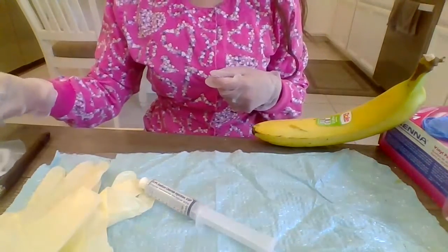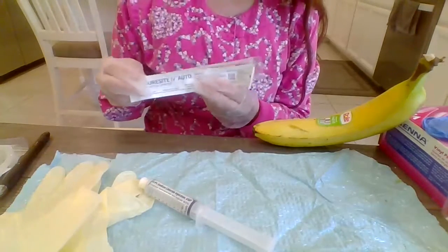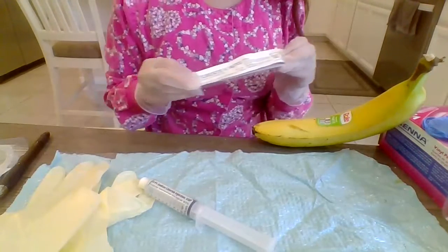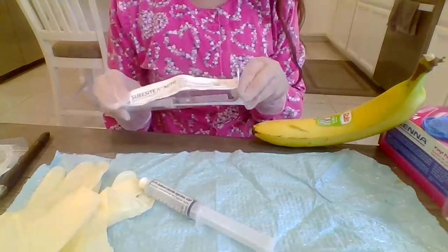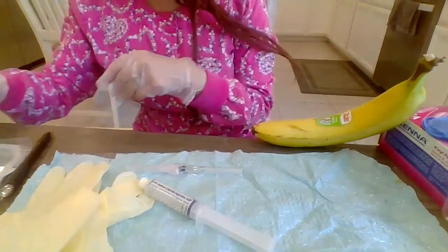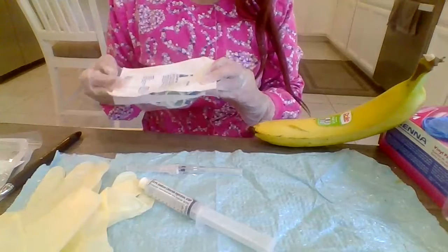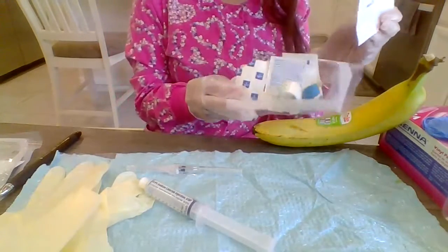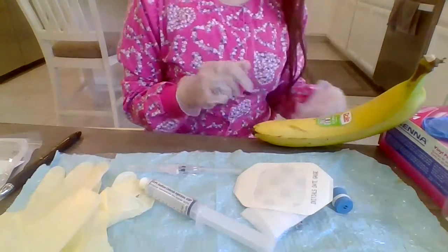I have also chosen a 20 gauge IV catheter because Miss Banana has a small arm and small veins. I'm just going to open the package and drop it in the sterile field. I also have an IV starter kit, unopened. I'm going to open it and drop it in the sterile field where I can touch it.